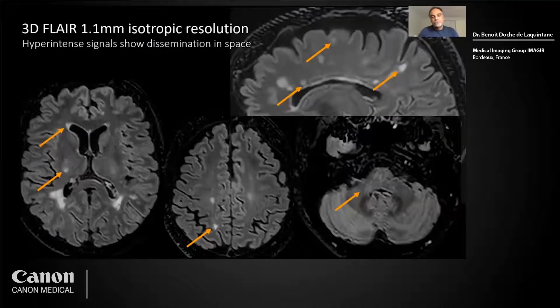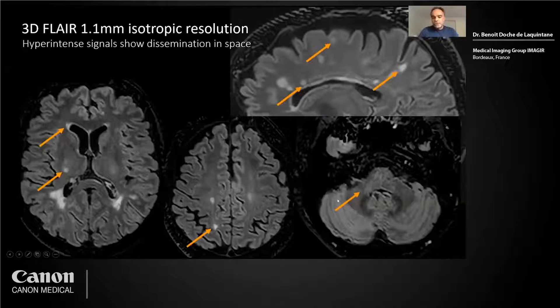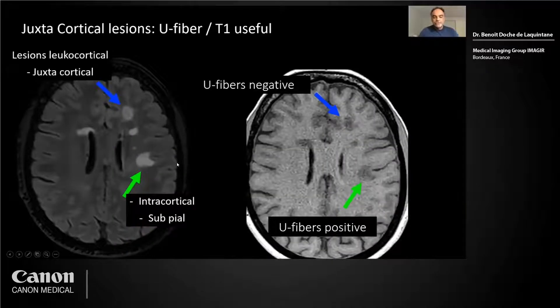The 3D FLAIR is the first sequence — it's isotropic resolution and it's used to see the T2 hyperintense signal to show the dissemination in space. Here you have some periventricular lesions, some juxtacortical lesions, and some infratentorial and juxtacortical lesions. That's the dissemination in space; another topic is the spine for the dissemination in space.